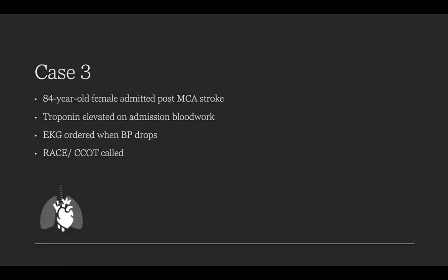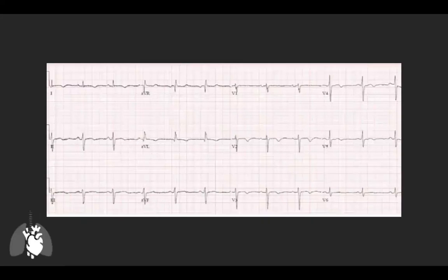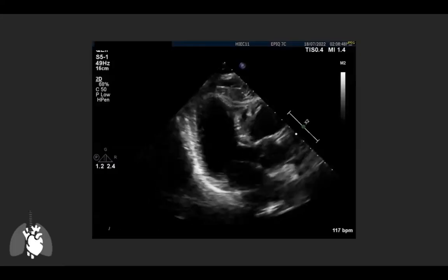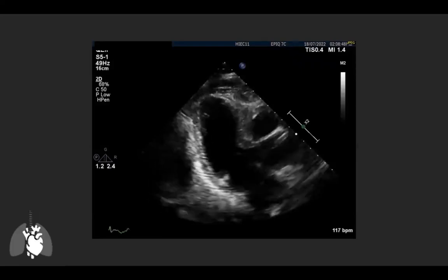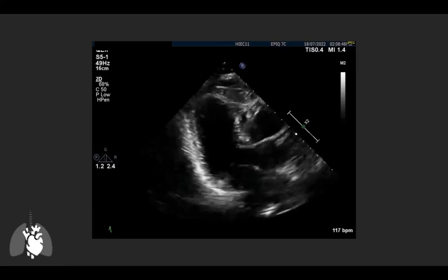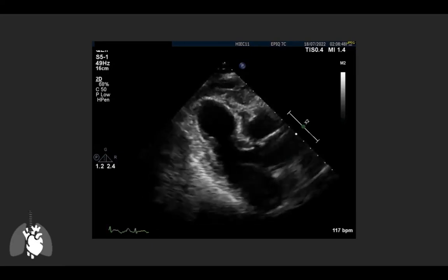Case three: an 84-year-old female admitted to neurology post-MCA stroke. Routine blood work revealed an elevated troponin, and an EKG was ordered when her blood pressure dropped in the emergency department. The rapid response or CCOT team was asked to assess her. Her EKG shows sinus rhythm with anterior T-wave abnormalities. The parasternal long axis is not a perfect view — it's somewhat a hybrid of an apical three-chamber — so inference is limited, but caveats noted.